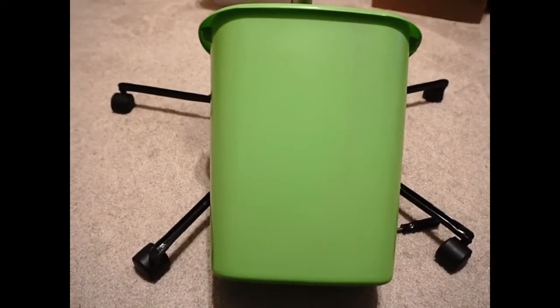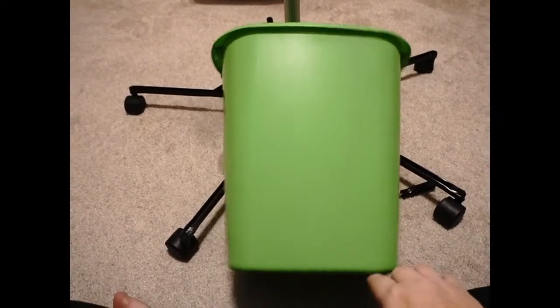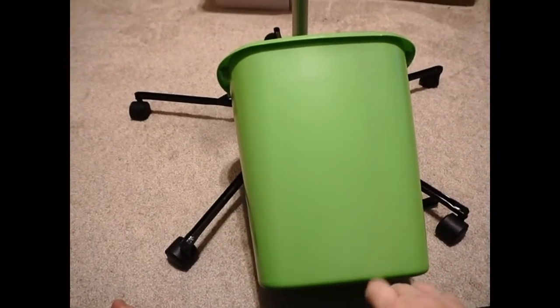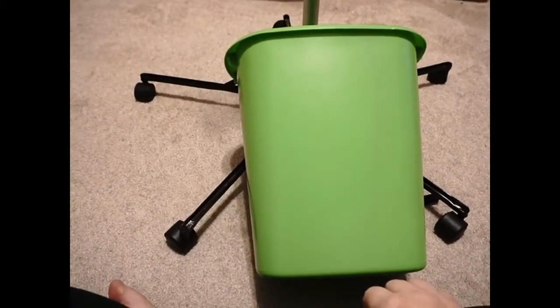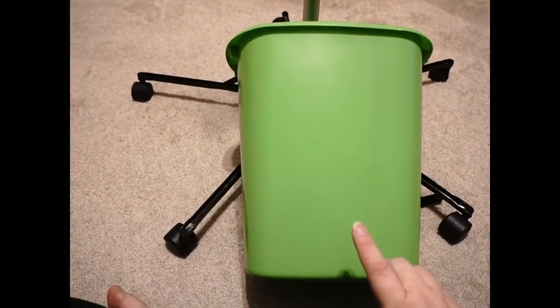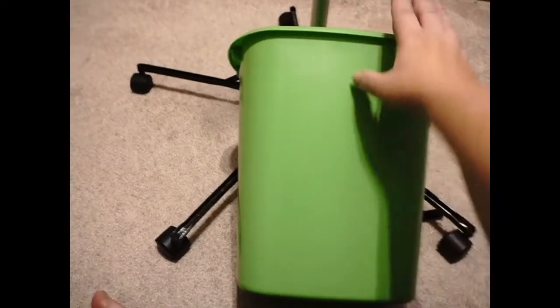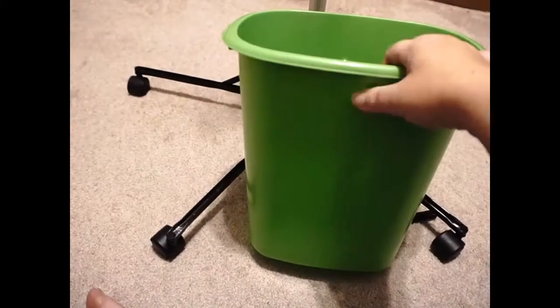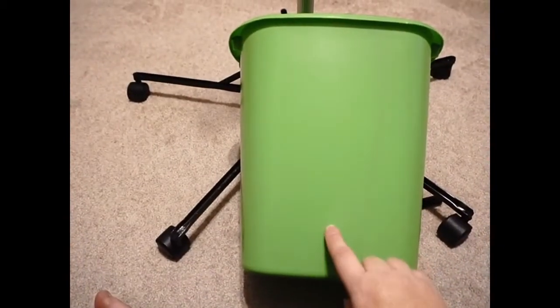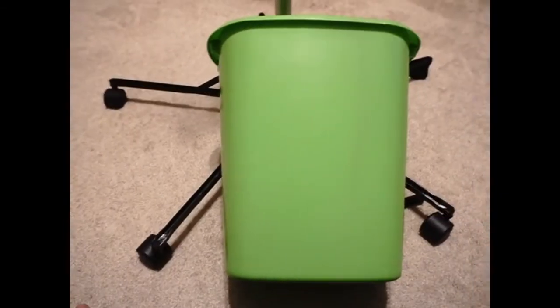This is just a regular Dollar Tree garbage can. Emery picked out green because green is one of her favorite colors and it's what she wants her bedroom colors to be when we remodel. For FYI, this may be a Dollar Tree garbage can but it is very thick plastic, so when we drill through it, it will be kind of hard.